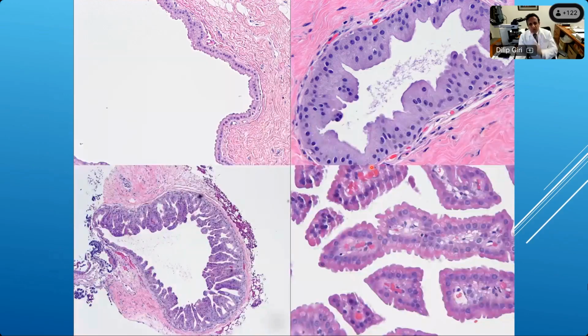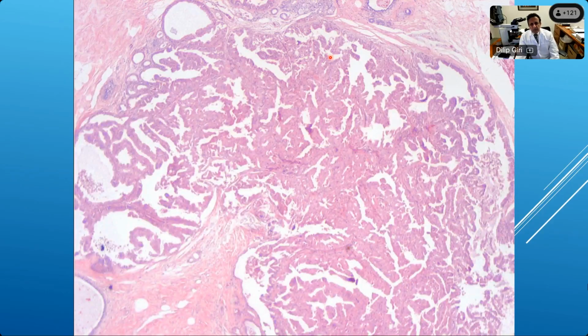Now, these apocrine changes can sometimes be quite puzzling. They can be quite proliferative even when they are benign. And they can throw various architectural patterns, papillary and cribriform and micropapillary and so on, and yet they may be benign, but it may be difficult in some unusual instances, as we will see. So for example, here, this is a cystic papillary apocrine hyperplasia. Now this, to a beginner, may actually look like some kind of atypical proliferative lesion.